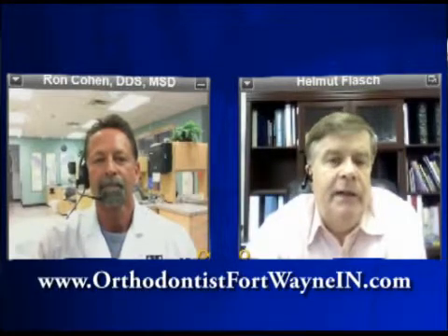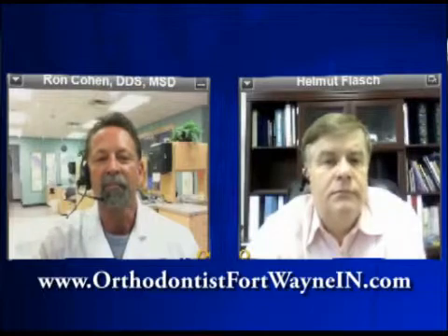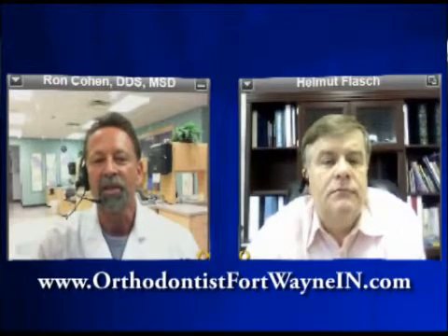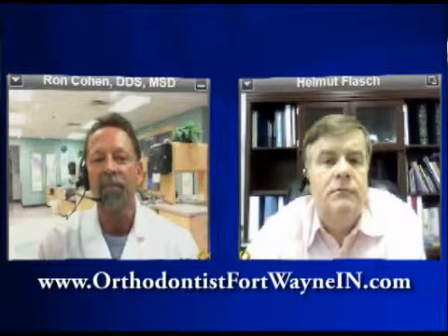What was that name again? It's called a cone beam CT. Medical machines use a straight line called a fan type X-ray. The dental machine uses a cone beam, meaning that the X-ray that comes out is cone shaped, so you don't have to have as much exposure to it. It gets it all at one time.